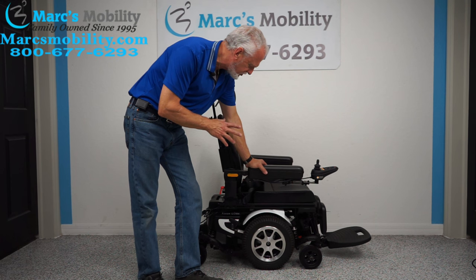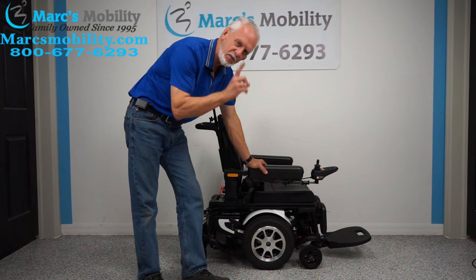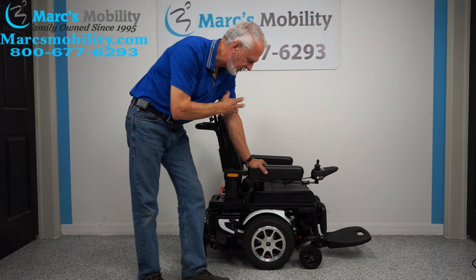Merit's Vision Ultra Power Chair. This power chair has one mile — it was delivered and someone never used it.